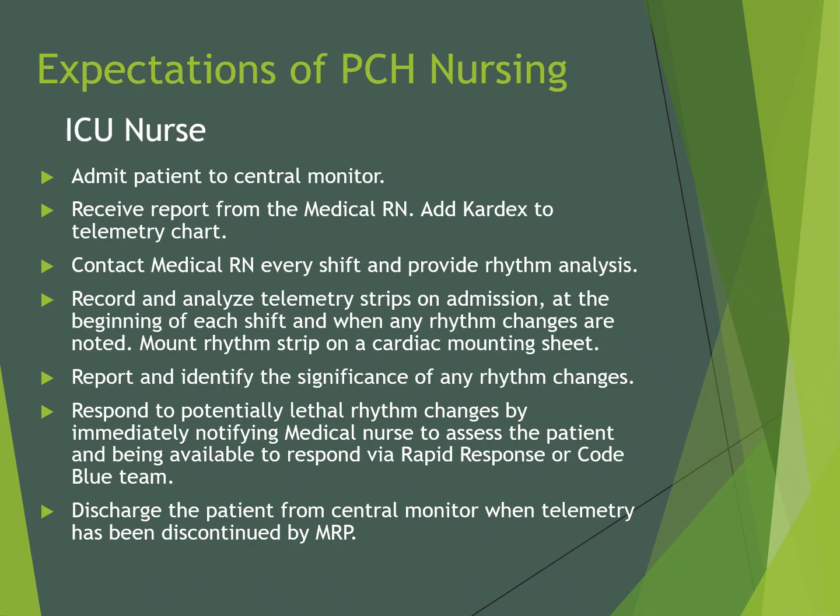The ICU nurse will be responsible for admitting the patient to the central monitor and receiving report from the medical nurse. The ICU nurse will contact the medical nurse every shift and provide rhythm analysis. The ICU nurse is responsible for recording and analyzing telemetry strip on admission, at the beginning of each shift, and when any rhythm changes are noted.